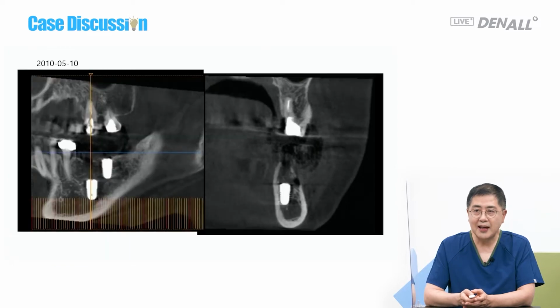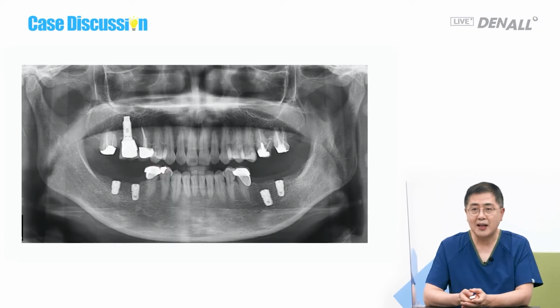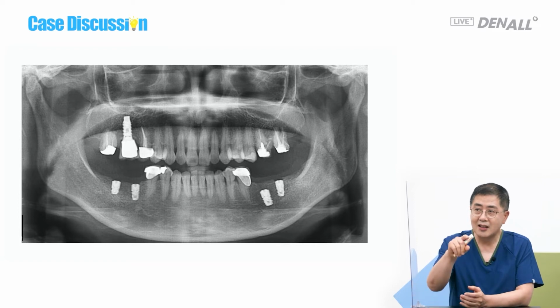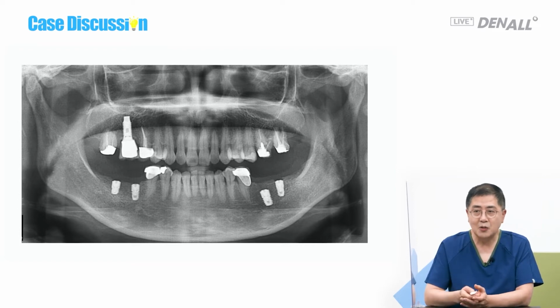I drilled into the cortical bone and lifted up. It had nothing to do with the mandibular canal. I tried to place one size bigger implant this time again, but it fell 3 or 4 millimeters below. It was submerged like this, and later the prosthesis was delivered.